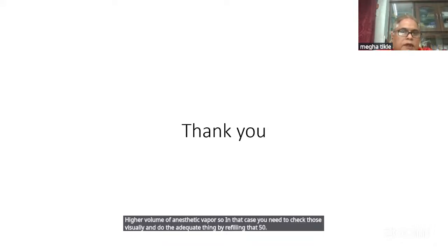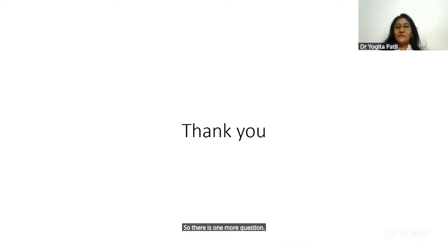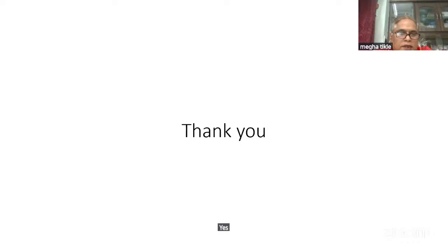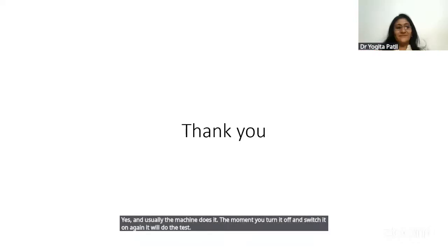There is one more question. Is it necessary to do a leak test every time? Yes, and usually the machine does it. The moment you turn it off and switch it on again, it will do the test. It will not go forward otherwise.